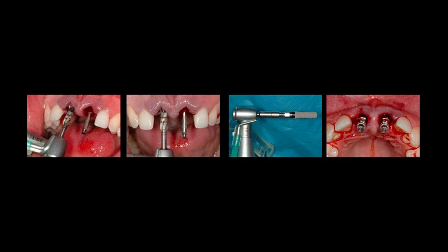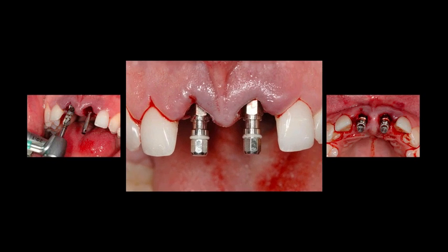Jim placed the implants with a flapless technique into the sockets, but more palatally positioned. So you engage the palatal bone and leave the buccal plate of bone intact as much as possible, and graft the space between the buccal of the implants and the buccal plate of bone. Now this case was done 4.5 years ago. We used Straumann TE level implants. We didn't use the bone level implants because they were not available at the time. If I was doing the case today, we would use the bone level implants because they're even better for a case such as this. So here are the implants in place.